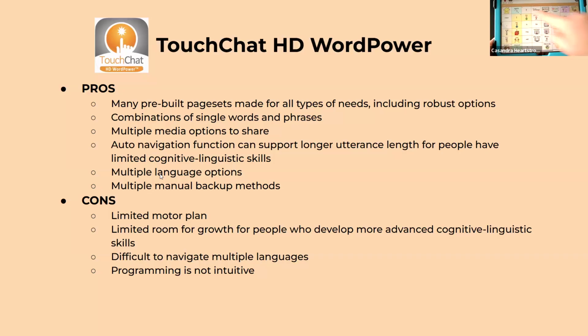It's got multiple language options, including French, Hebrew, Spanish, and more. It also has multiple backup methods. So when you've customized a page set, you can back it up a variety of different ways. So if the device gets lost or broken or the app gets deleted, there's a way to get that backup back. So those are some pros for Touch Chat.